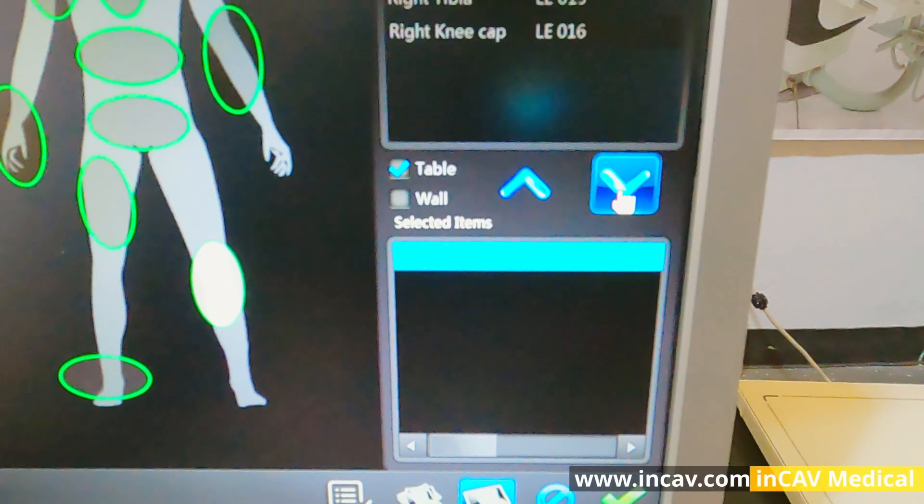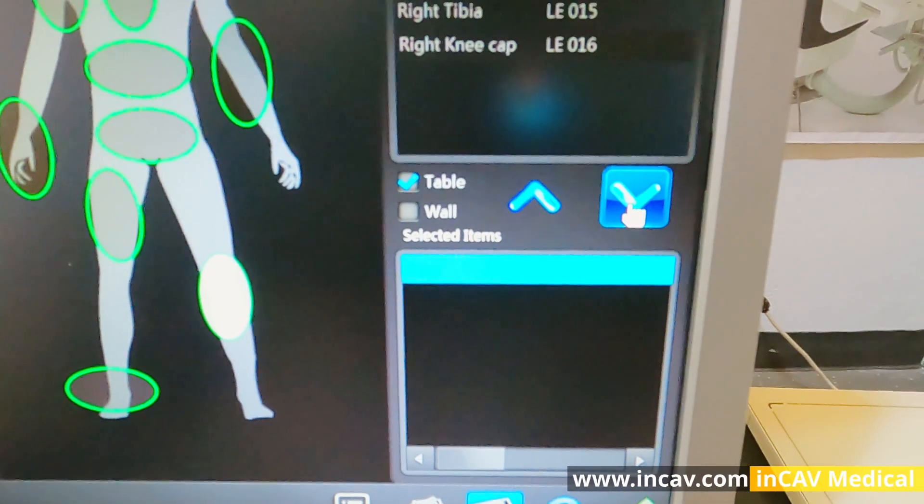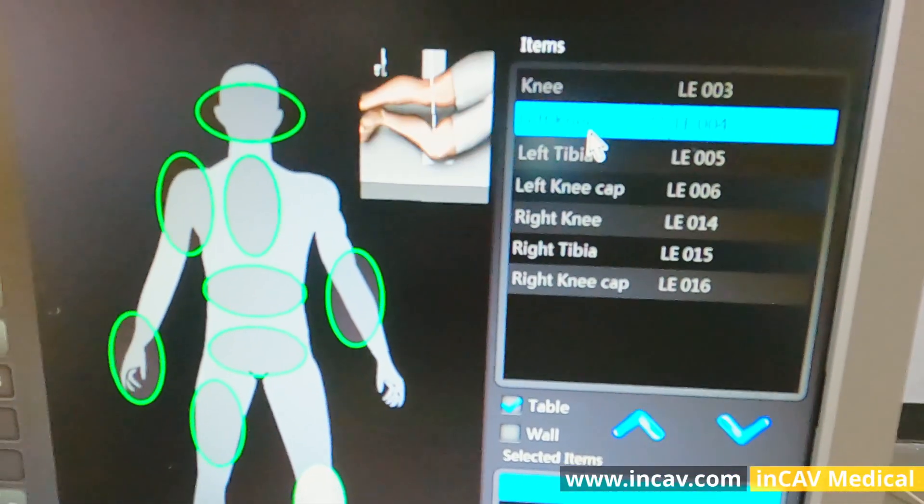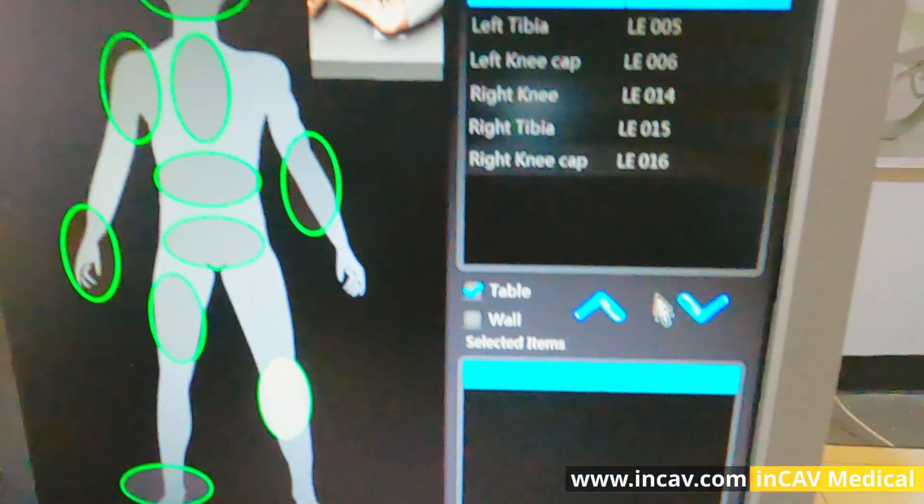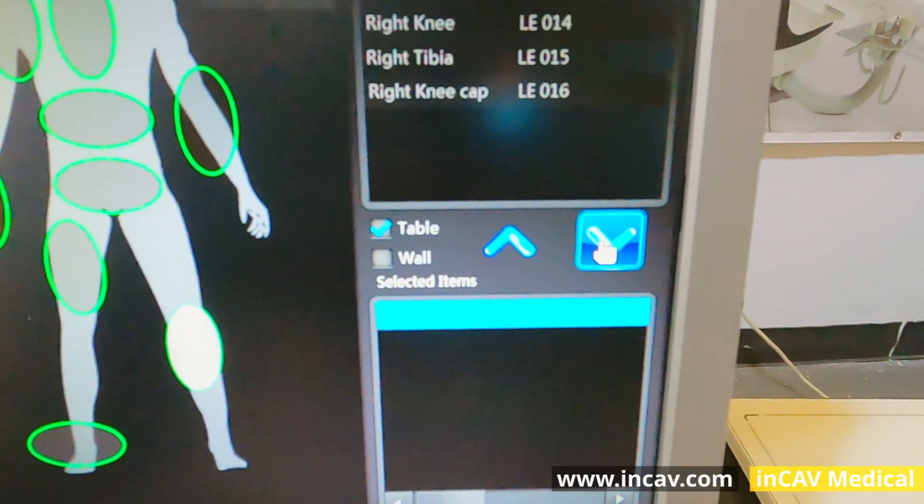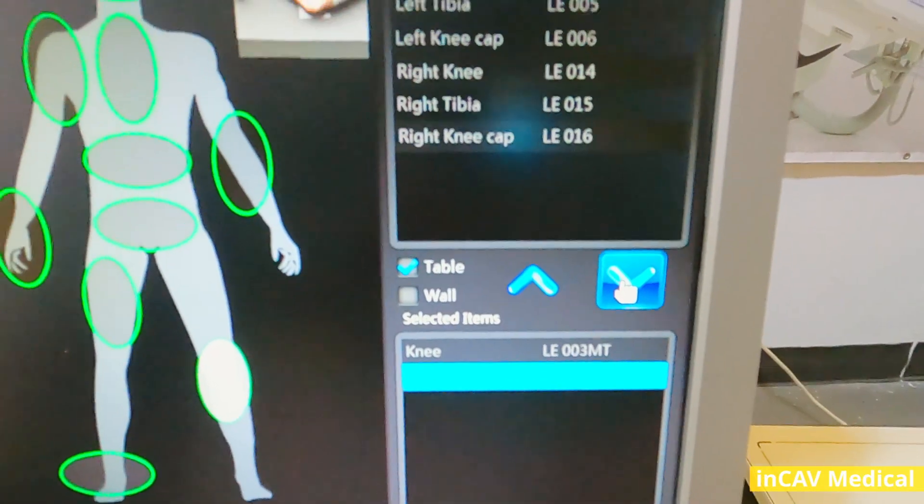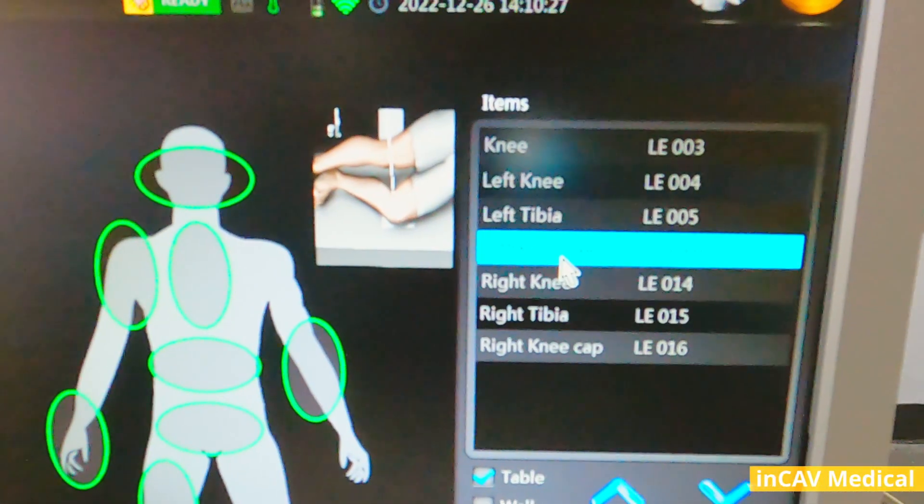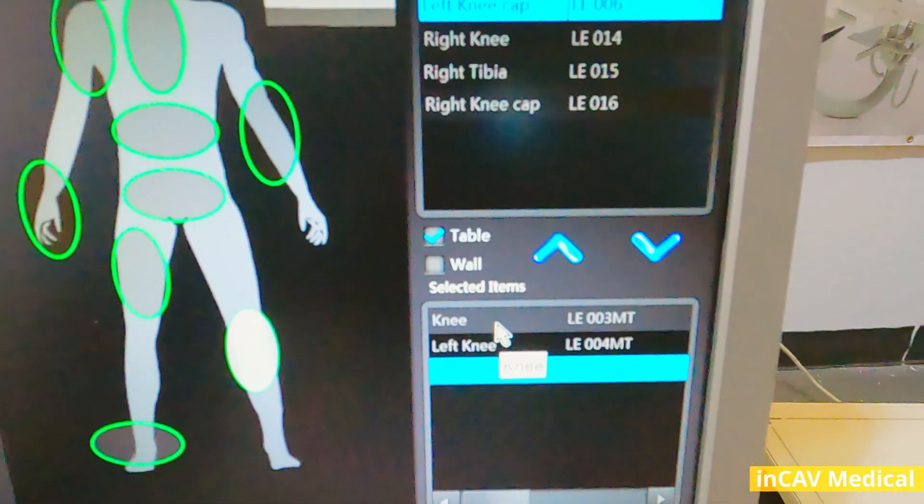When you choose the right study, just click on the arrow to add this to the procedure list. You can add many, but for this example we are going to do only three.